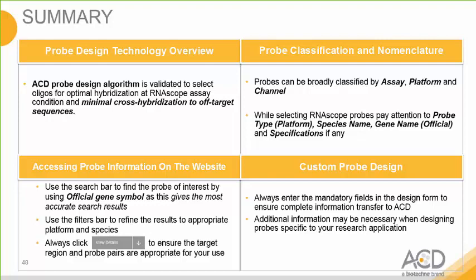The reason is sometimes the transcription does occur on the opposite strand, and lots of these events are not even well documented or not annotated. So in this case, the result may be confusing. The signal you get may be not just a random assay background, but actual signal. Therefore, we recommend a non-specific bacterial gene, dapB, as the negative control. So this is the best negative control.